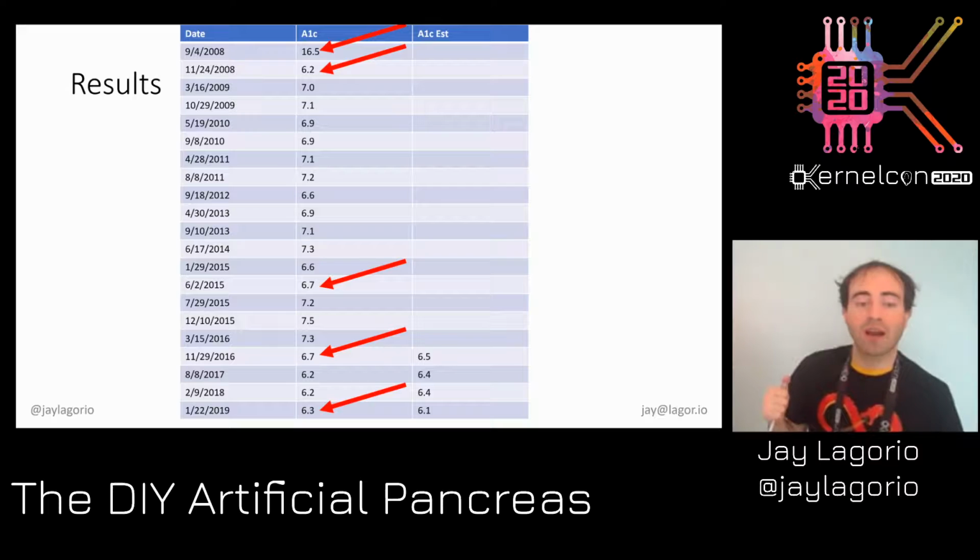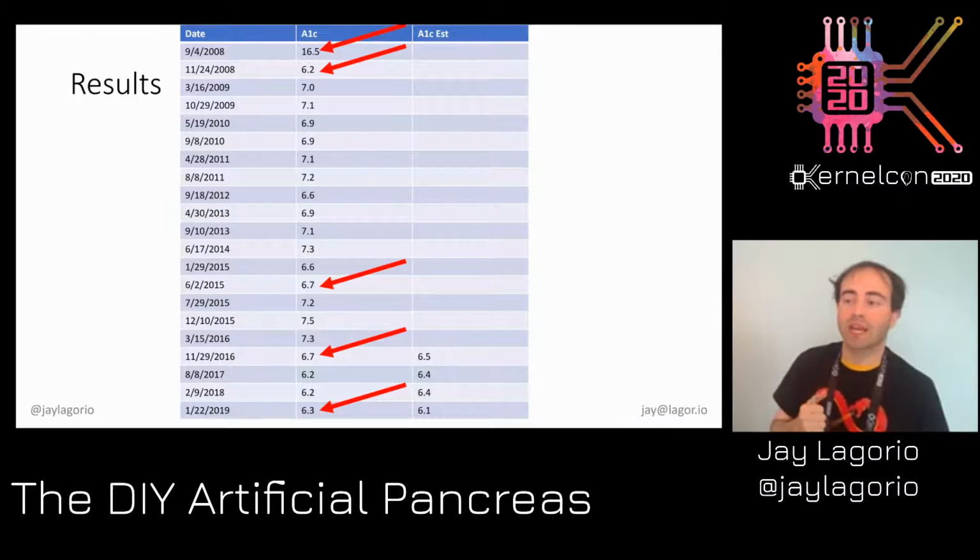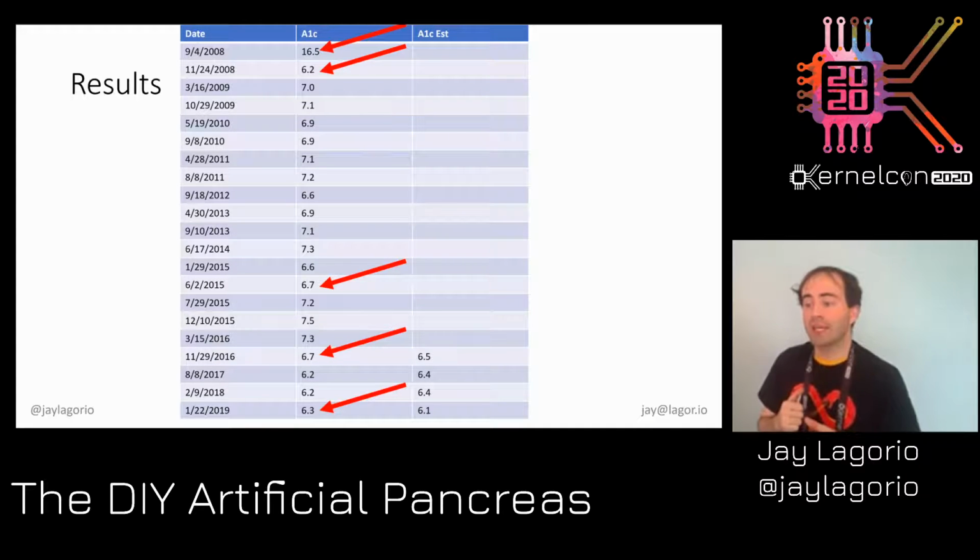And that's where I was about a year ago, at 6.3, and that was super good. I wanted to update this chart. I was supposed to have an appointment to do that two weeks ago, but everybody got busy with something, so I don't have a new number for you. Night Scout says the estimate is about 6.0, so about 0.2% one way or the other is not big either way, but 6.0 is a really good number. So those are my results and my changes.